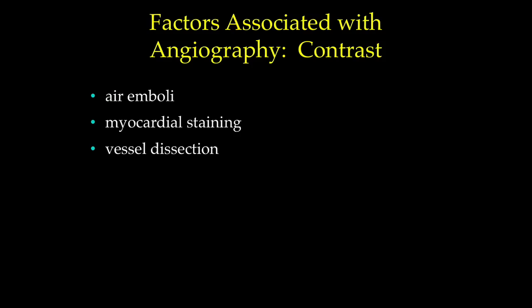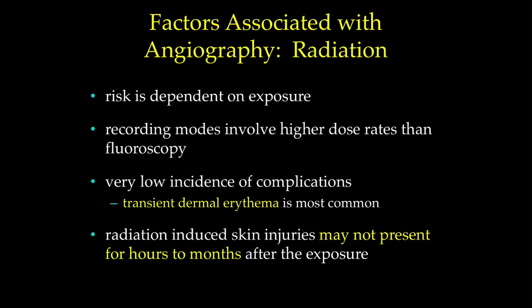When we inject, we can get air emboli, myocardial staining if the catheter is right up against the myocardium, or even vessel dissection. So, radiation. Angiography involves radiation, and the risk is dependent on exposure.